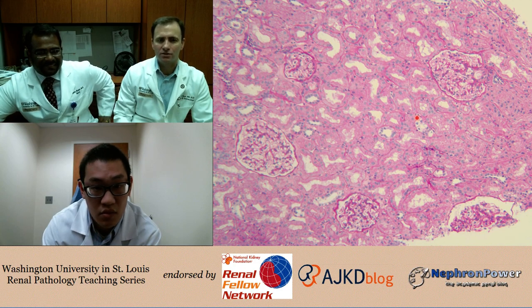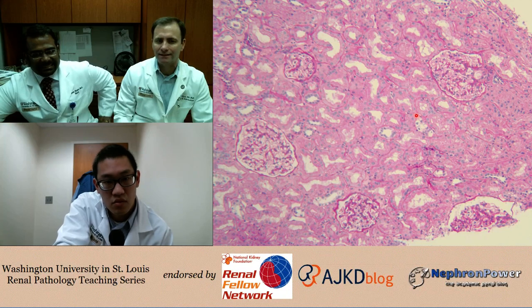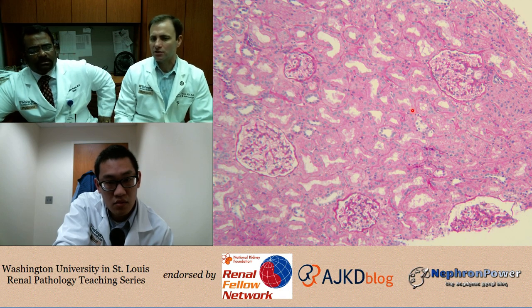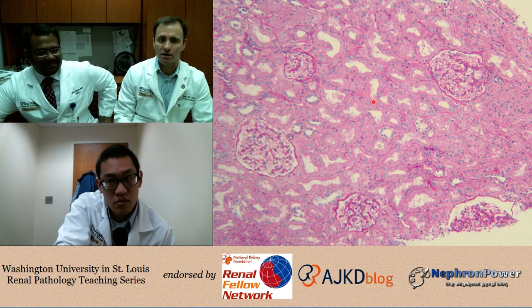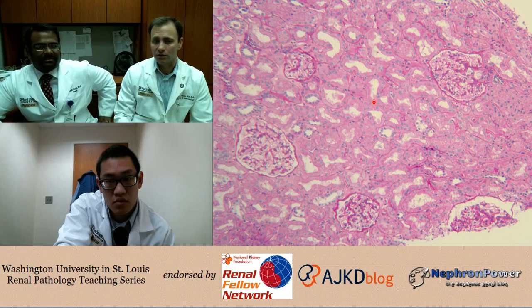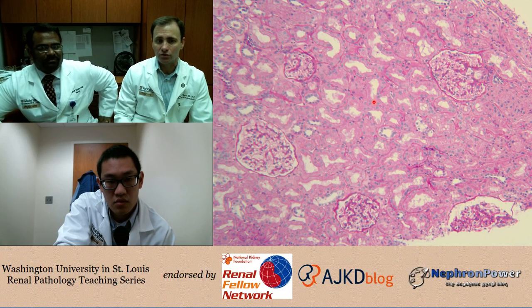Very good. And you mentioned also focal segmental glomerulosclerosis. Now, what part of the kidney are we more likely to see a segmental scar, particularly early in the disease process? Cortex, corticomedullary junction, medulla. Cortex. At the corticomedullary junction is actually where those lesions first pop up. So if you only have a biopsy of cortex, you're less likely to appreciate one of those. And of course, it's dependent on how many glomeruli you sample because it is a focal lesion.